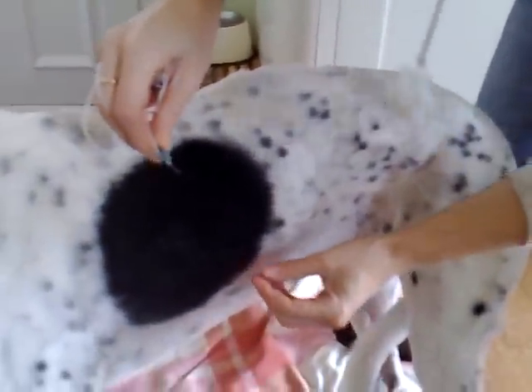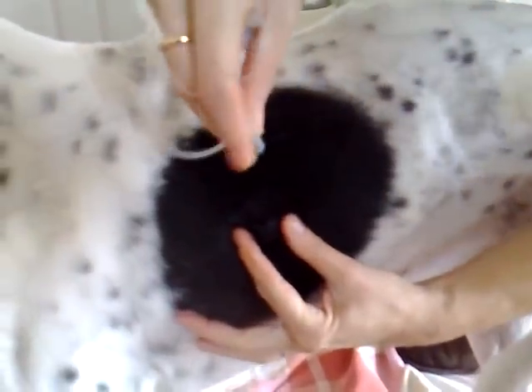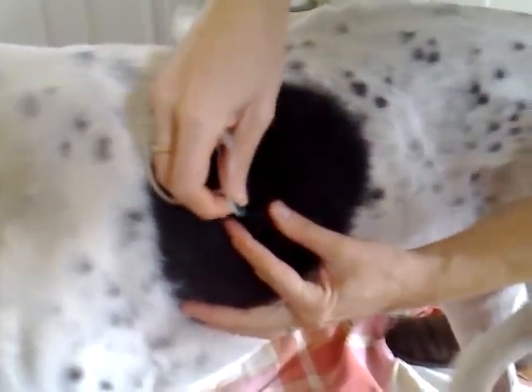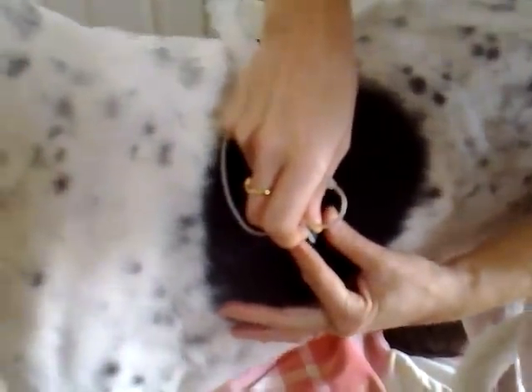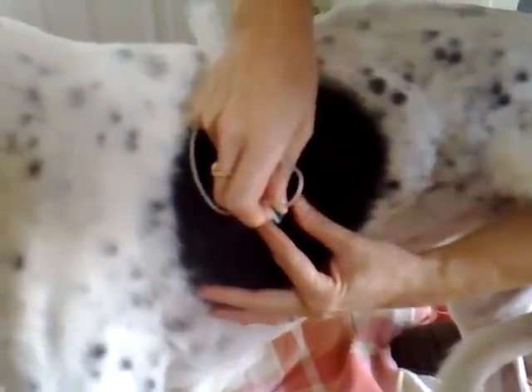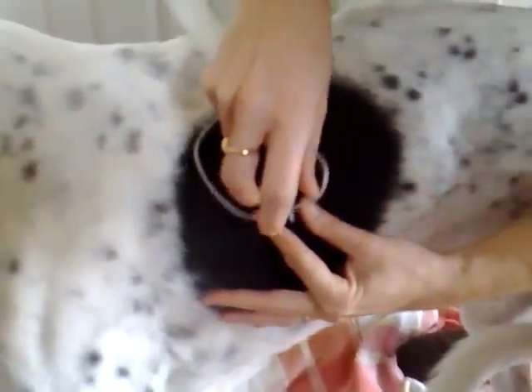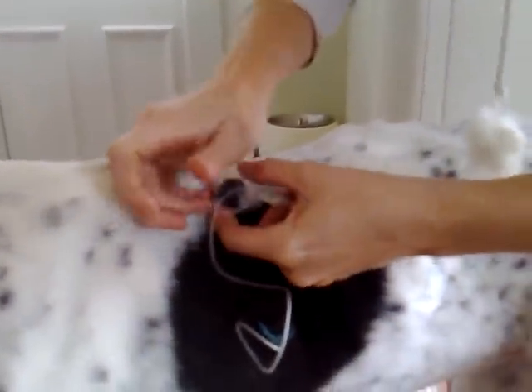The port has already been cleaned with hibby scrub. Hold it steady on each side and firmly press the needle into the centre. You can't go too far because there's a metal back to the port.